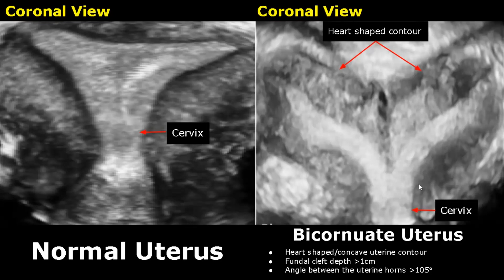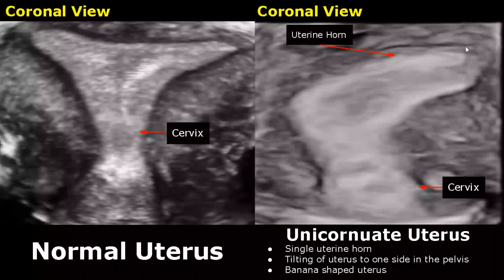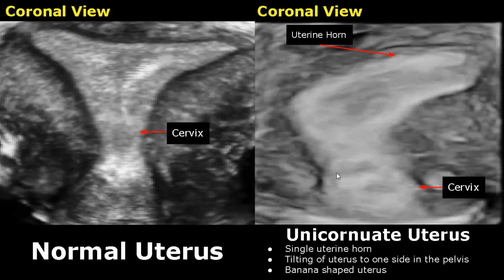A unicornuate uterus will have only one uterine horn connected to only a single fallopian tube. It is difficult to see on 2D ultrasound; we may see tilting of the uterus to one side in the pelvis. A unicornuate uterus has a banana shape and is seen very well in a 3D coronal image. Only a single uterine horn is found, and we can see the banana-shaped uterus tilted to one side.